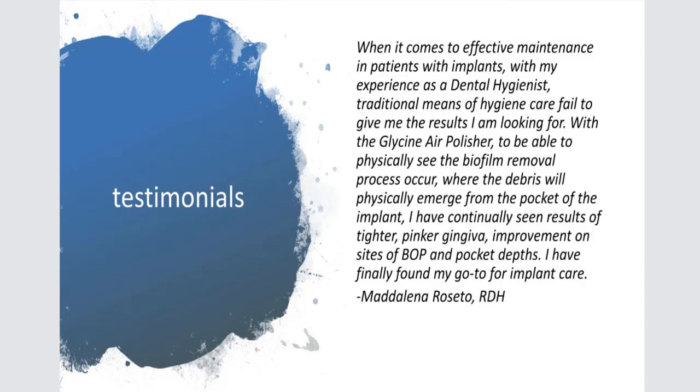of the surface. And somebody's asking, can you go subgingival with the metal tip? Absolutely. Again, it's designed to do that because it's low pressure. There's no water, and you're going to keep it at a 30 or 90 degree to the implant surface.